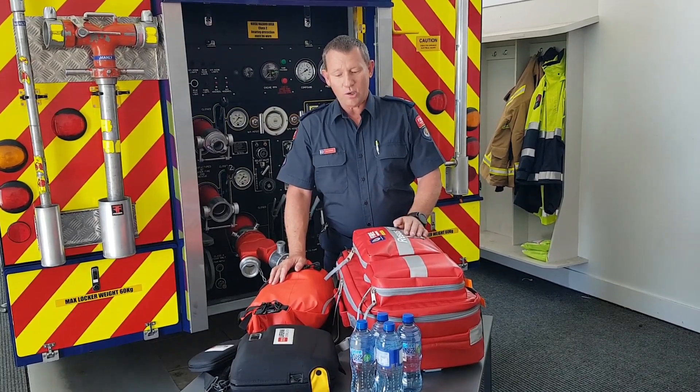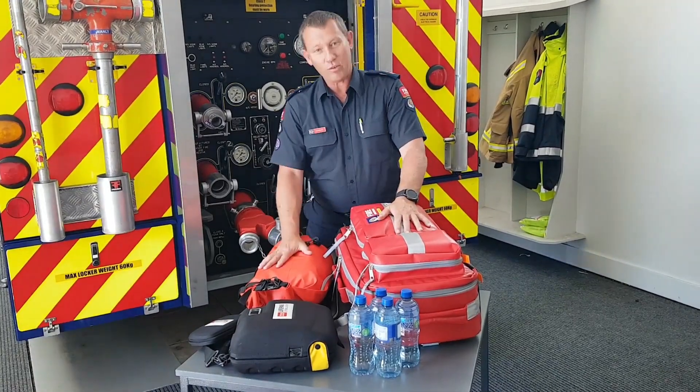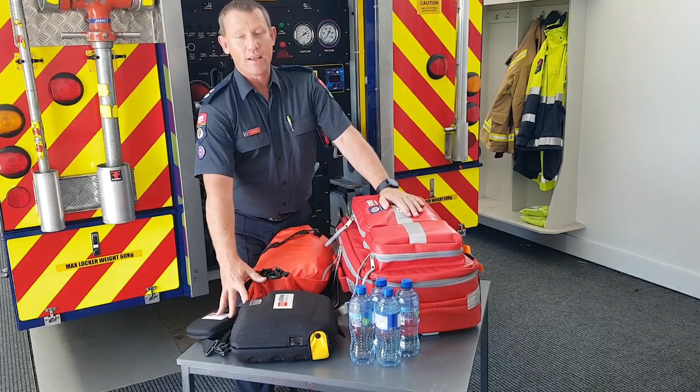So the emergency medical response pack — this is it here. The new kit: bag with blankets and towels, drinking water, and your AED. That's the whole package.